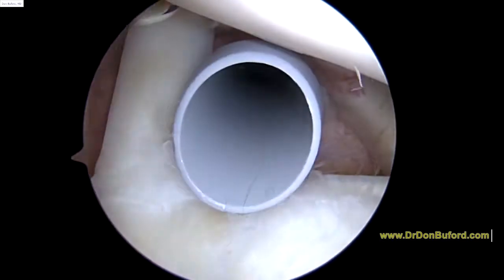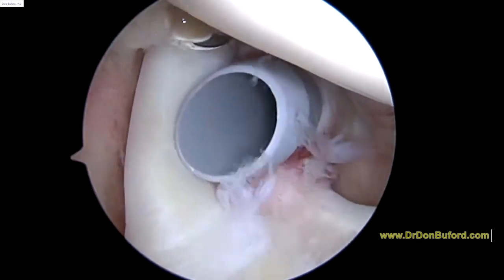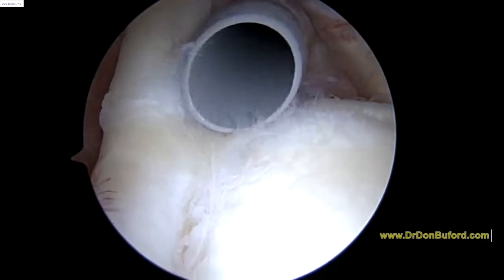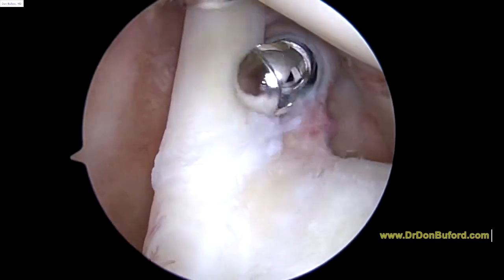This is a great cannula you see coming in the front of the shoulder. It's coming through a part of the shoulder called the rotator interval. To the left of that is the biceps tendon, and you can see a little bit of fraying at the biceps anchor.